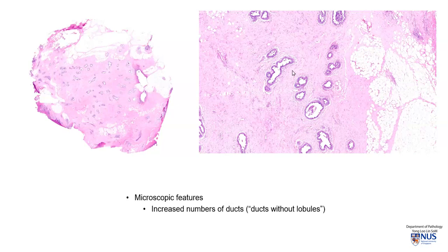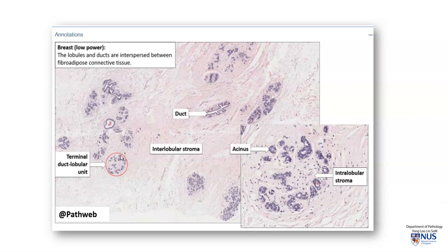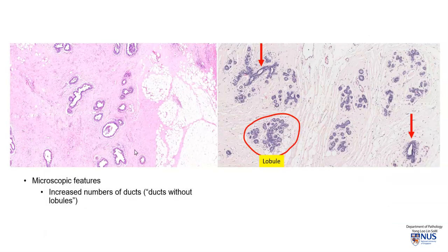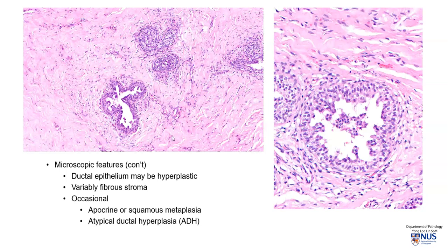Microscopically, there are increased ducts not accompanied by lobules — ducts without lobules. Comparing gynecomastia on the left with the normal female breast on the right, you can see a lobule and ducts in the female breast, whereas in gynecomastia these ducts appear quite naked. There may sometimes be hyperplasia of the ductal epithelium, and the stroma is variably thick or dense in terms of collagen.